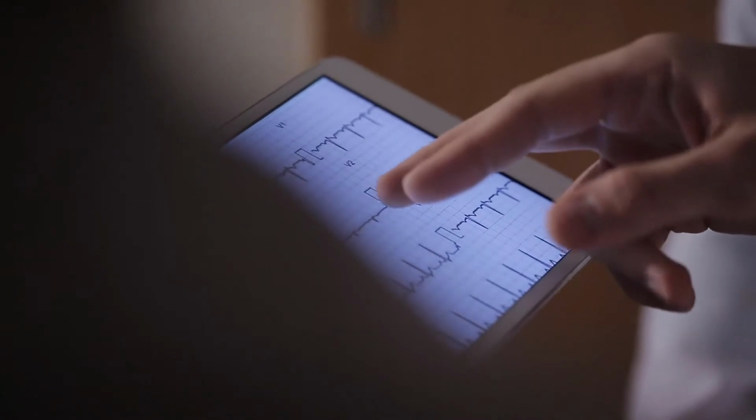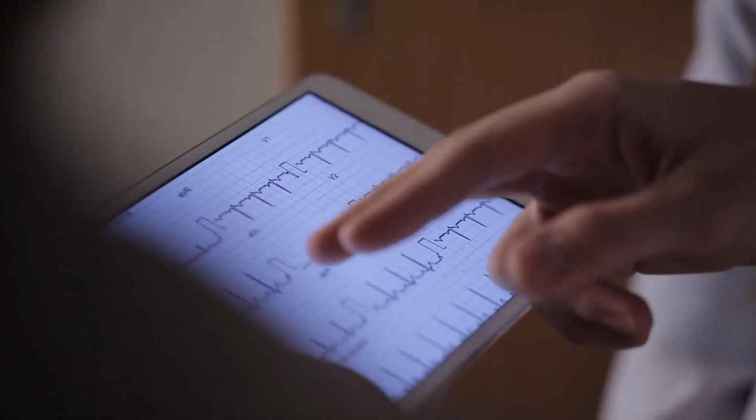Oxygen monitoring is used primarily in an operating room setting when surgeons are concerned that a patient's levels might drop. This can be a particular worry with cardiac surgery, as well as procedures with high rates of blood loss, and surgeries involving children. The anesthesiologist can use cerebral oximetry along with other technology to monitor the patient throughout the procedure. If signs of complications or problems develop, the anesthesiologist can respond and alert the care team.